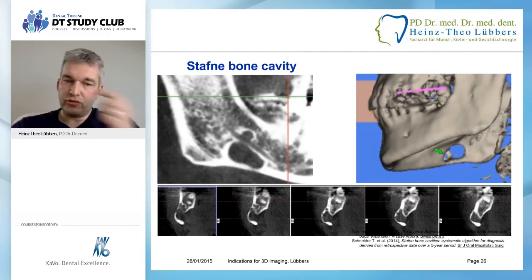You should not refer to the 3D that is reconstructed by the software, because this 3D surface rendering, as it's called correctly, is always cheating, kind of. It's trying to give you a smooth surface, but to achieve that, it's going to produce either holes like here, where there actually is no hole.